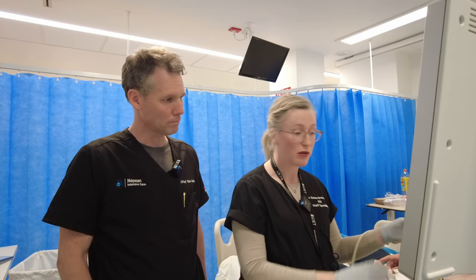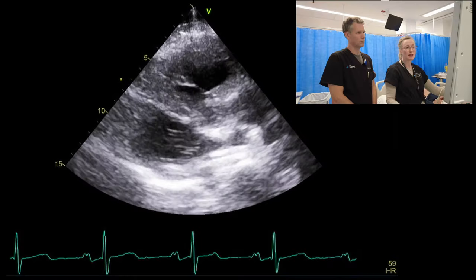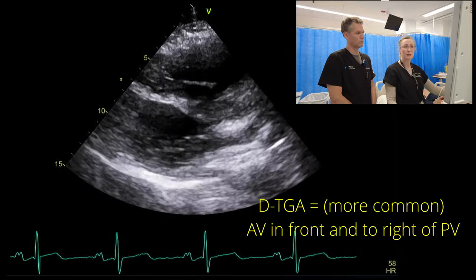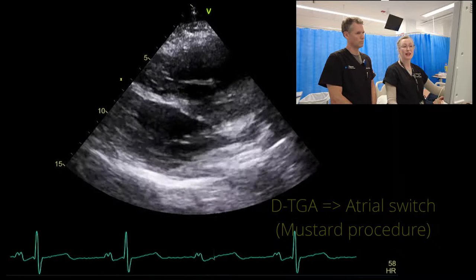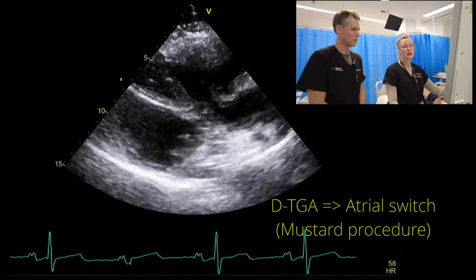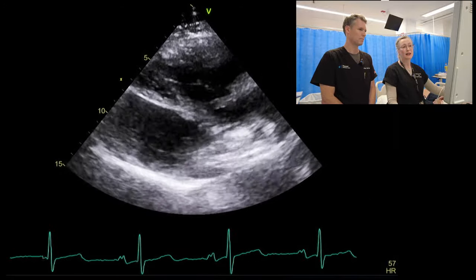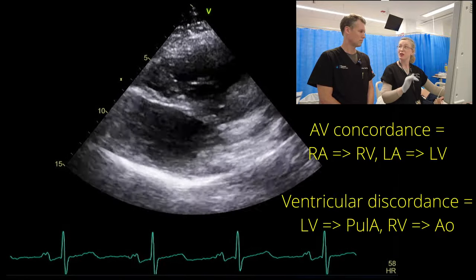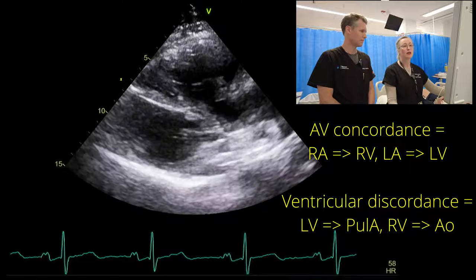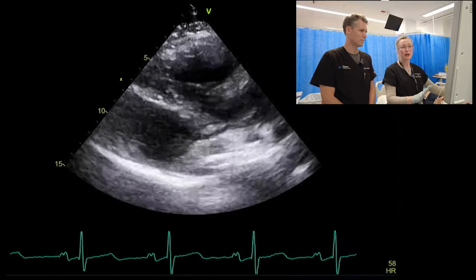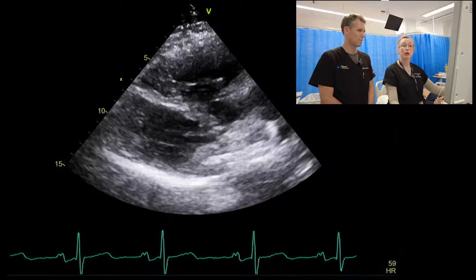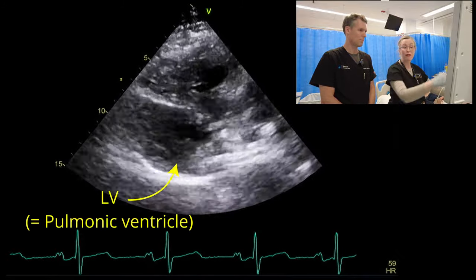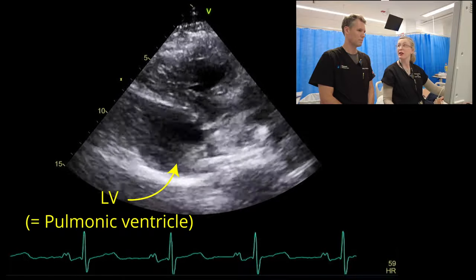Moving on to the parasternal views. We had a little information for this patient in that we know he was a DTGA and actually had an atrial switch — a Mustard procedure — which means that he has AV concordance but still has discordance between his ventricles and his great vessels. The first thing to recognise is this parasternal long axis looks highly abnormal to what we're used to. What we have here is our morphological left ventricle, which is actually our sub-pulmonic ventricle.